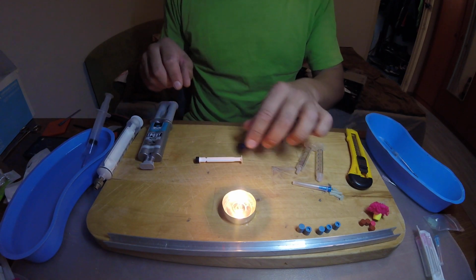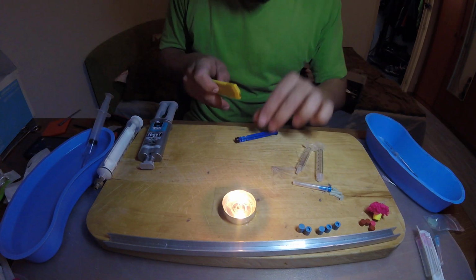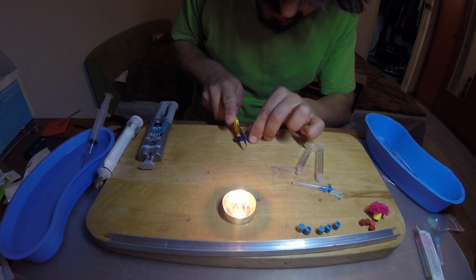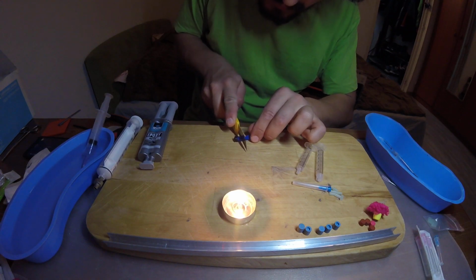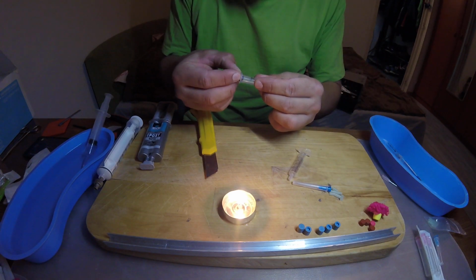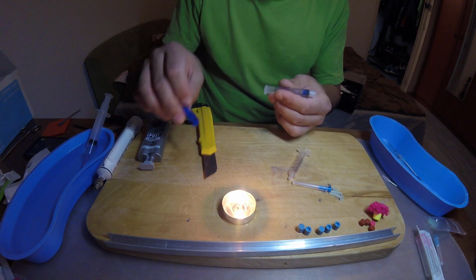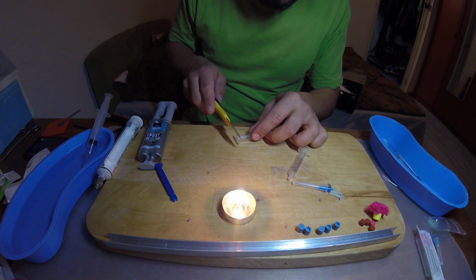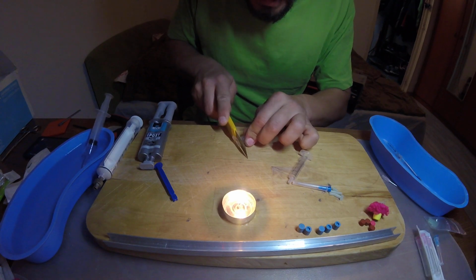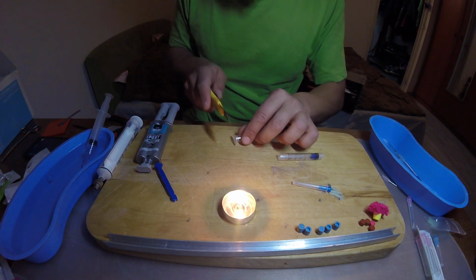So we take the pistons out, we take this off, and then we are gonna cut the piston. It has to be cut from the base of it. Throw this out, and we're gonna put this one inside, and then push it back, and also cut these fingertips, the finger press, this is called. Cut this off. We're gonna do the same with the other one.